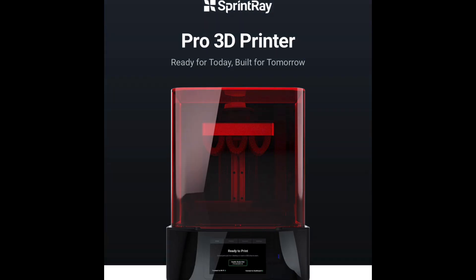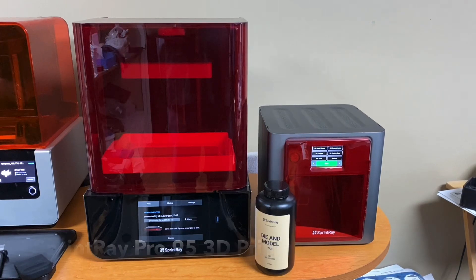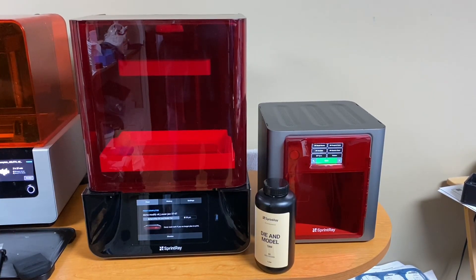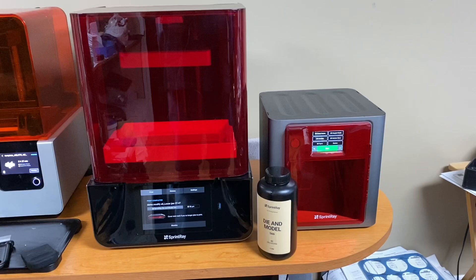If we look at the Sprintray Pro a little bit closer, you can see it has this orange hood. The hood is to protect the light from going in and curing the resin. It has a small footprint, which is quite nice - it's got a good design. It has this hood that lifts up and down so you can put your projects in and out.